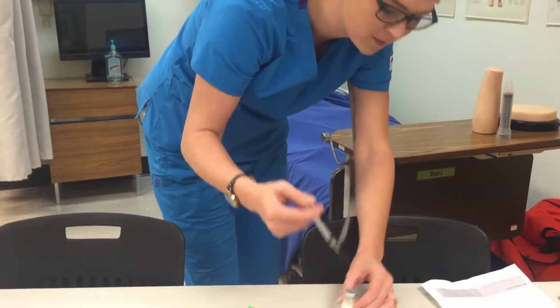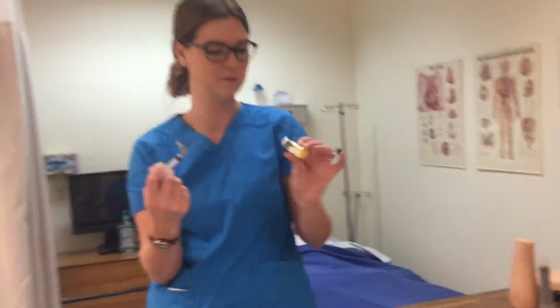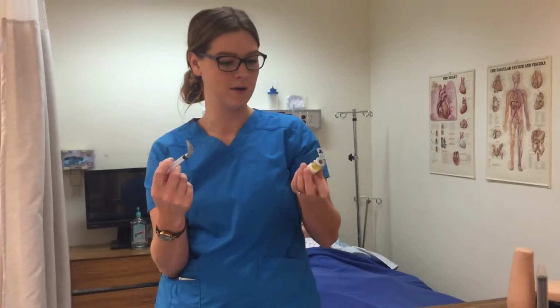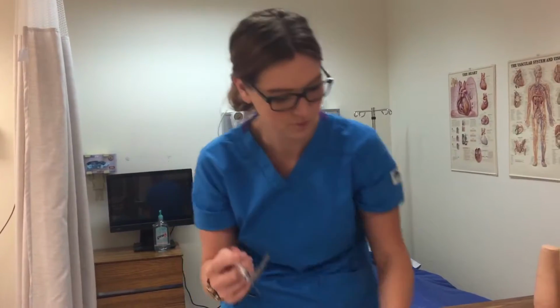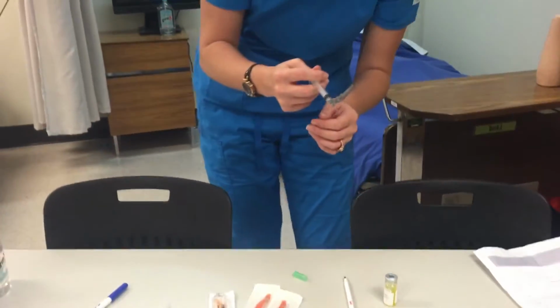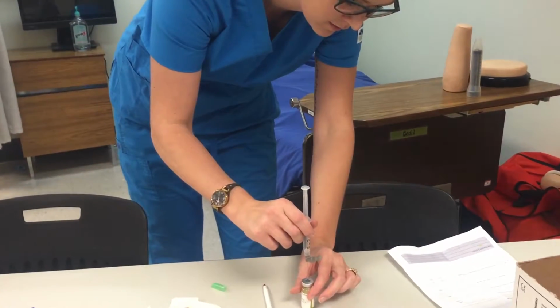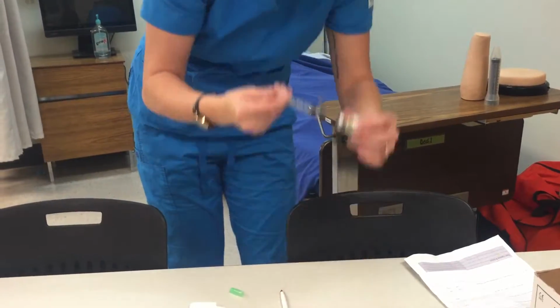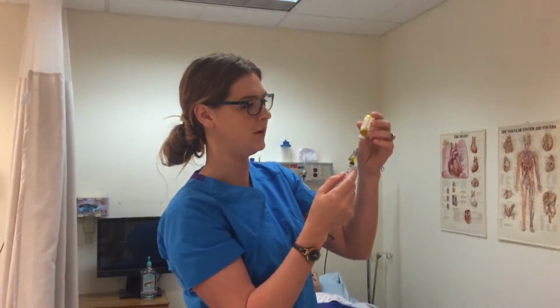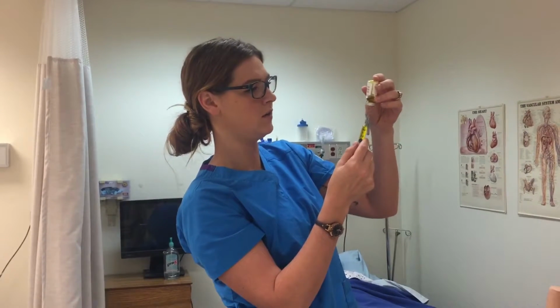Okay, so I'm not gonna put this down, and I'm just gonna slowly rotate this, not shake it, not be really aggressive, but just kind of mix it till I can see all the powder is dissolved. There's no clumps, it's all a uniform color. It's good to go. So now I'm gonna inject 3 mils of air into this. Flip it upside down and just let it fill. I'm gonna keep my needle into the liquid as much as possible, which is really kind of tricky.